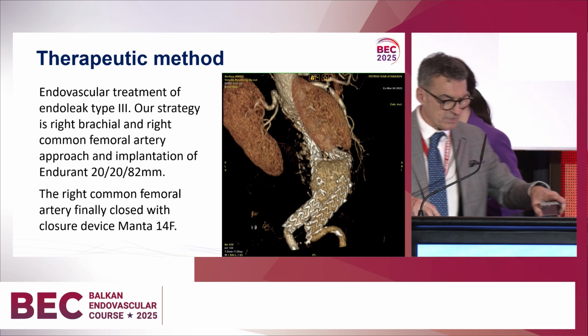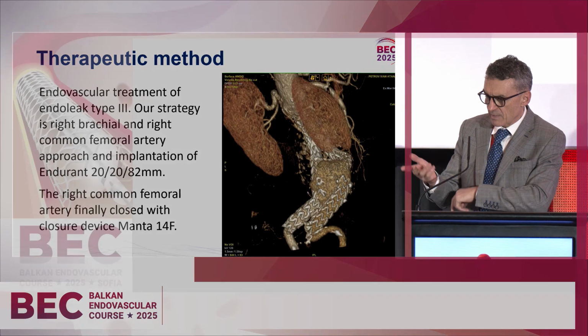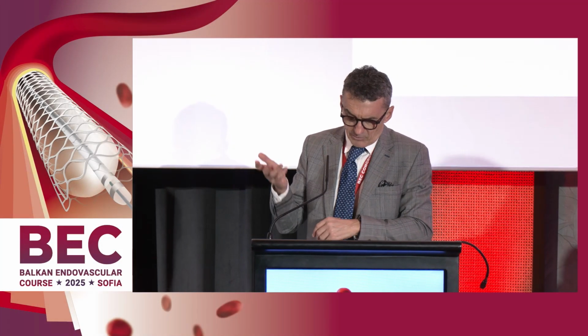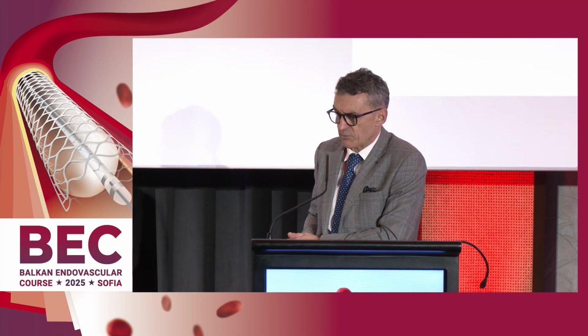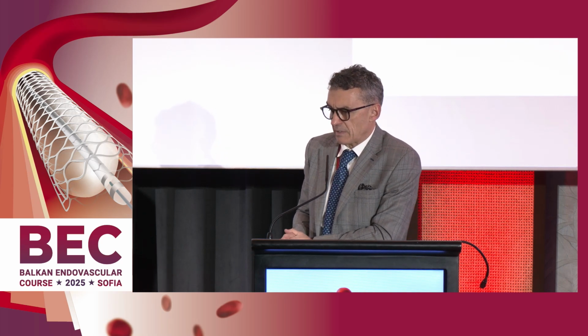Hopefully we'll see soon what our colleagues will do, but in fact what are the possibilities? Of course surgery is possible, but it would be quite risky for such an elderly patient.